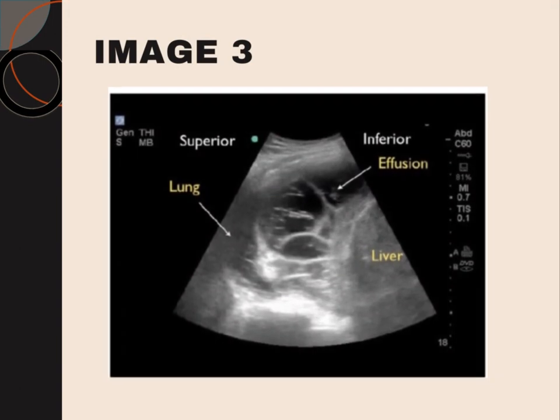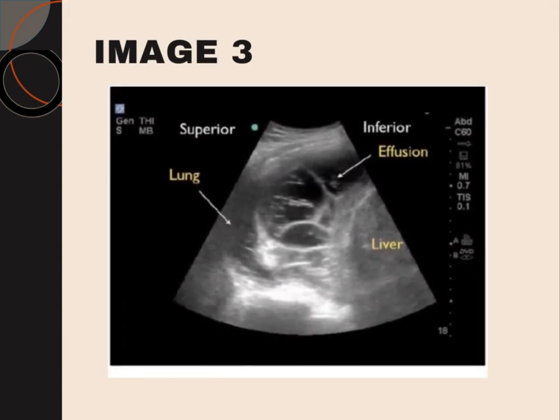So that's another image of complex pleural effusion, multi-septated or multiloculated, or septated effusion. This is a complex effusion, whether it is parapneumonic or a prolonged effusion, that needs intervention. Normally I've seen they end up with surgeries, because if we insert a tube, it just enters a single pocket and drains that single pocket, but not the other pockets. So just to get an idea of how septated or multiloculated effusions look.